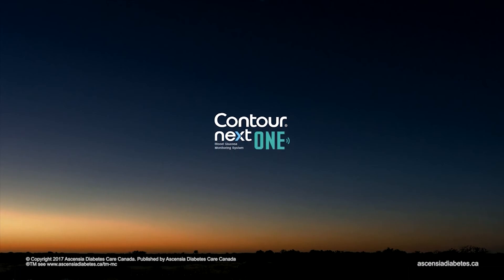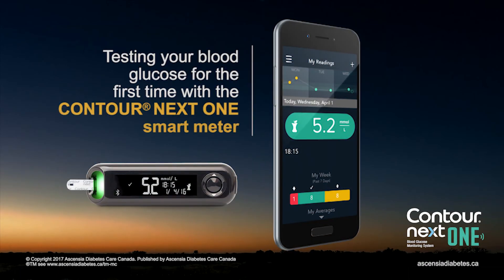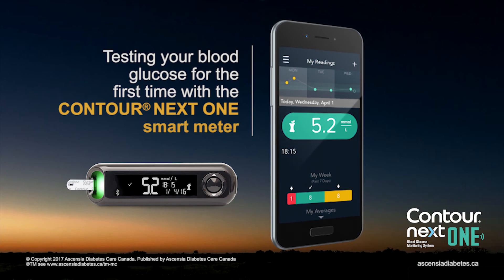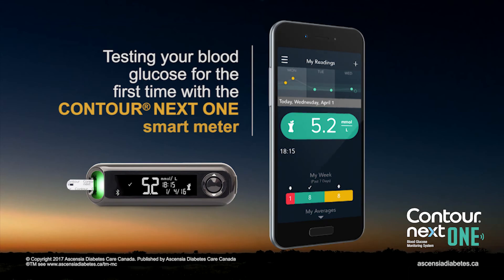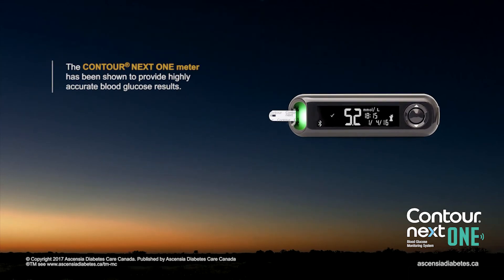Contournext One Blood Glucose Monitoring System. This video will show you how to test your blood glucose for the first time with the Contournext One Smart Meter. The Contournext One Meter has been shown to provide highly accurate blood glucose results.